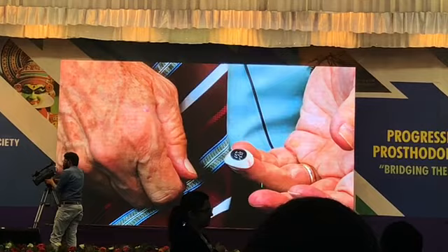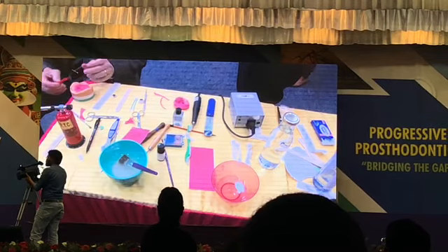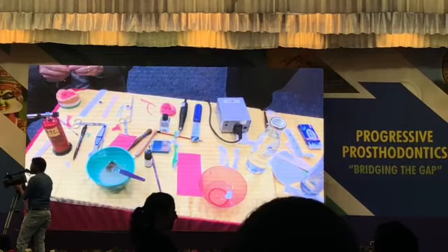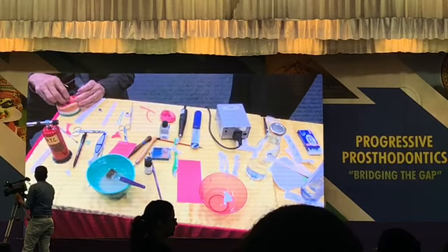And then you take some wax. You need to use hard modeling wax, not normal wax. Okay, Cavex, you get hardened wax sheets. Yeah, the harder the wax, the better it is. You almost want something like inlay wax, something similar to inlay wax.